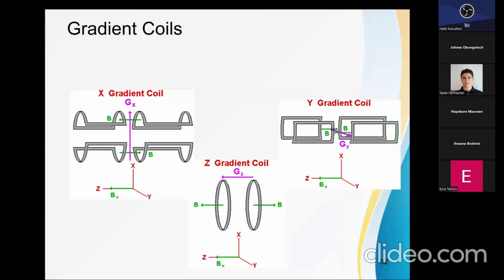So even if you are using permanent magnets, you might still need gradient coils that are made of electromagnets. You might be able to provide a standing gradient using permanent magnets, but its application can be very limited. You might have very few applications for that kind of gradient coil.